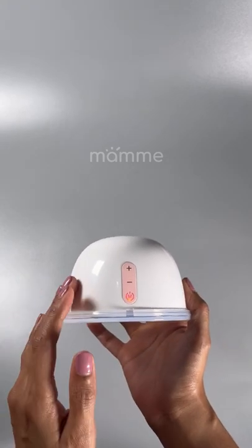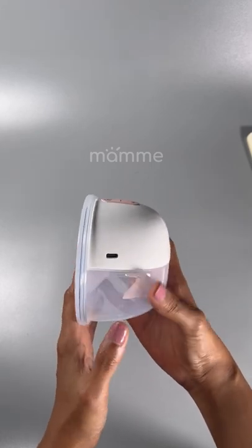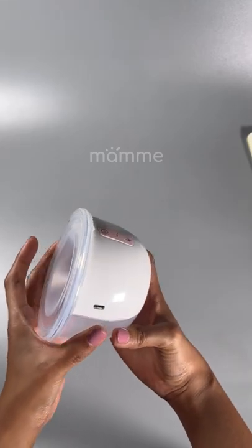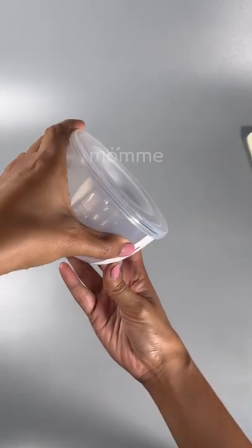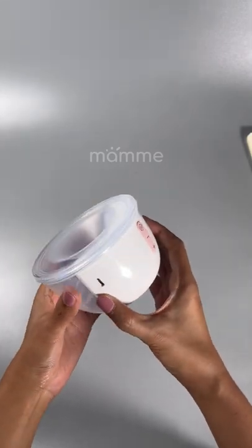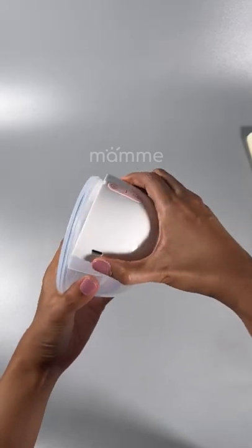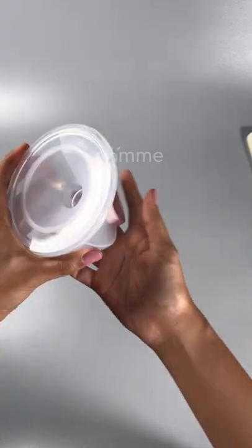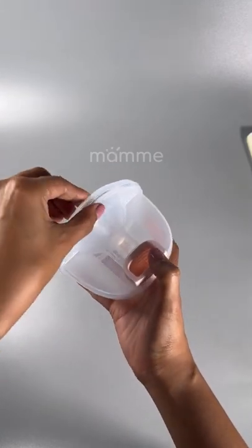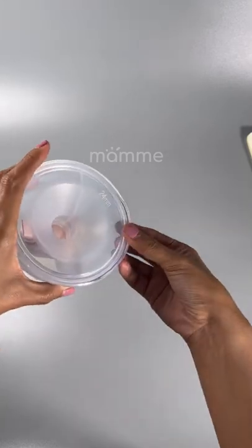So, one of the common errors that moms do is that nasisira ang pump is kapag nagpo-pour sila ng milk, kasama ang motor. Ganyan, hindi tinatanggal. This is a no-no. Please do not do this kasi masisira ang pump mo. Okay, so how do you do this? You will need to remove your motor first. Saka mo i-pour. There is a small hole here, but I suggest you do not use this kasi parang medyo mahirap siya i-pour. Medyo matagal.